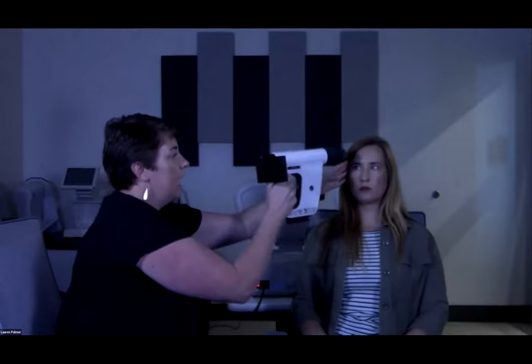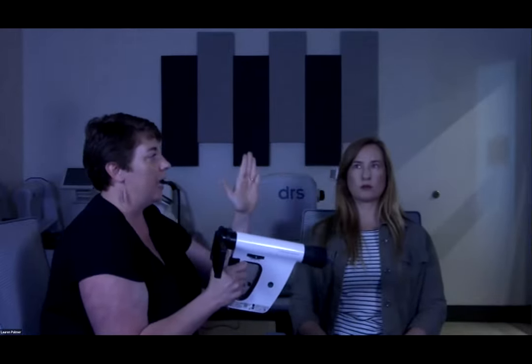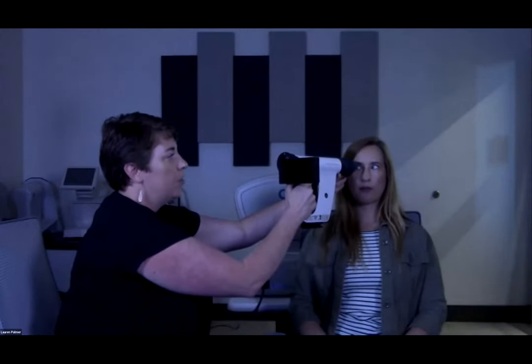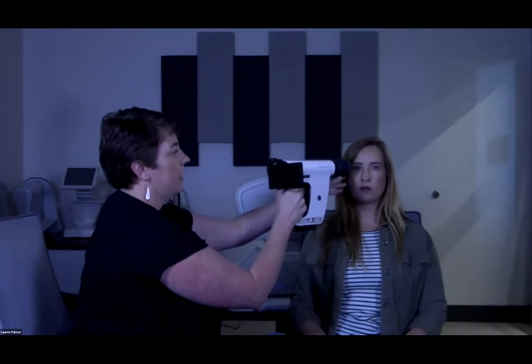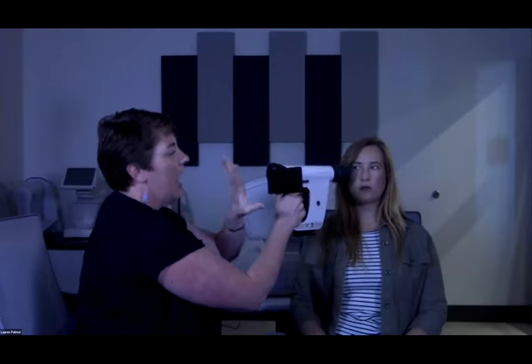When I land the camera in front of her face, you'll notice her head is facing forward. Her eyes are looking at a slight angle. And again, I'm just coming at about a 30 degree angle. You can use the corner of the patient's chair as a reference point. And I want to make sure that the image capture screen is in front of my face so that as I press the camera toward her eye, I can verify that I'm in the correct position.